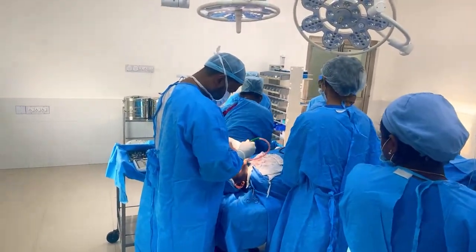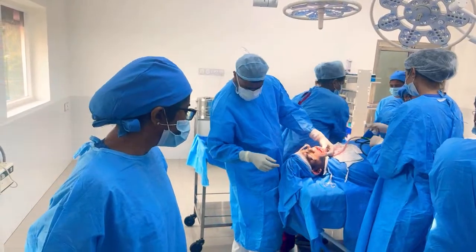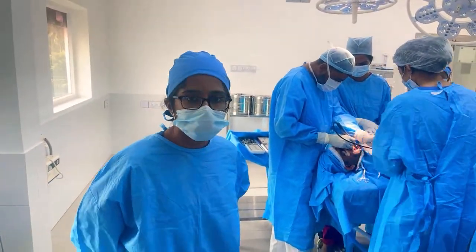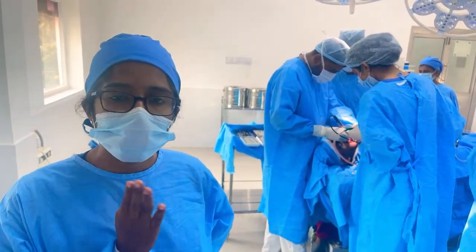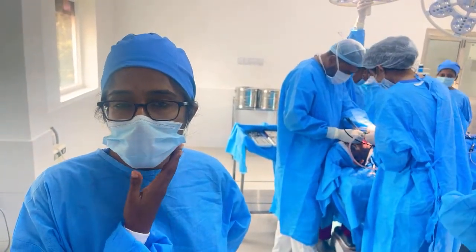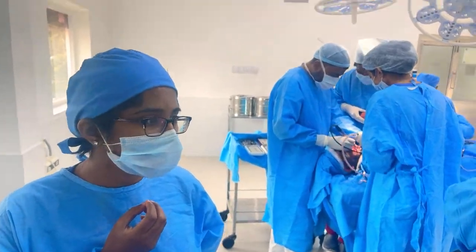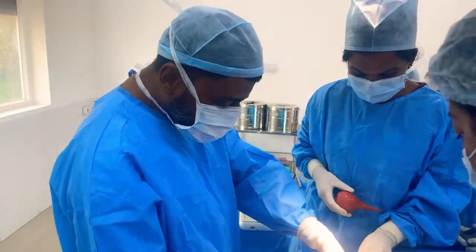So now we are done with the fixation, and we are going to start with what we call jaw sculpting, meaning once we have augmented, once we have brought the segment forward, we need to ensure that there are no sharp edges and it is completely symmetric on both the sides. It's also to ensure the correct shape of the chin and the jaw. Sculpting is like sculpting, you just sculpt it.